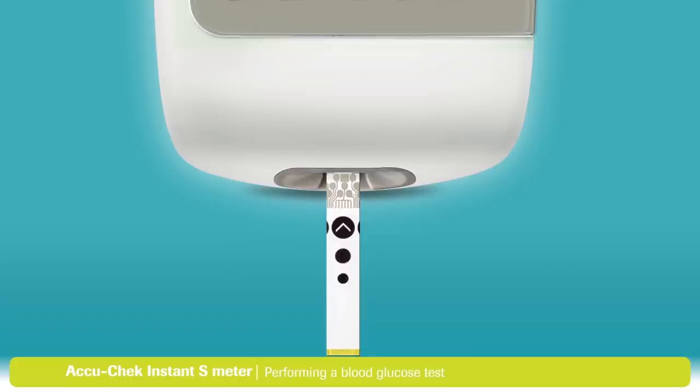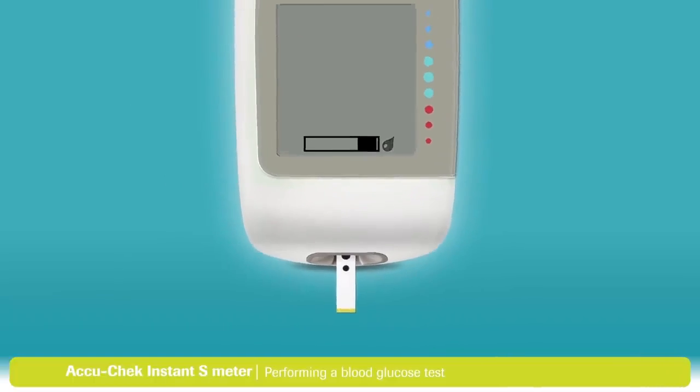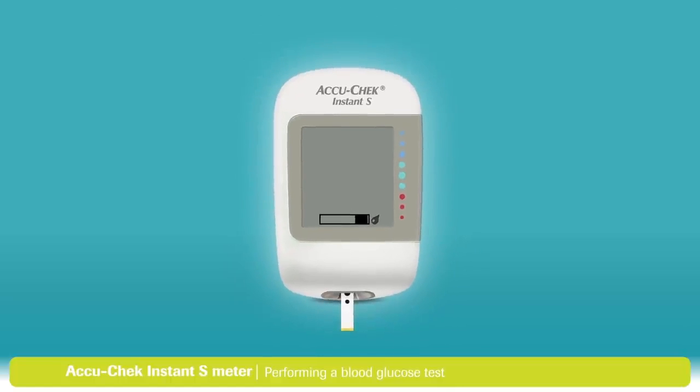Insert a fresh test strip, metallic end first, into the meter. The arrow in the black circle indicates the right direction. The meter will turn on automatically. A flashing blood drop symbol appears on the display.